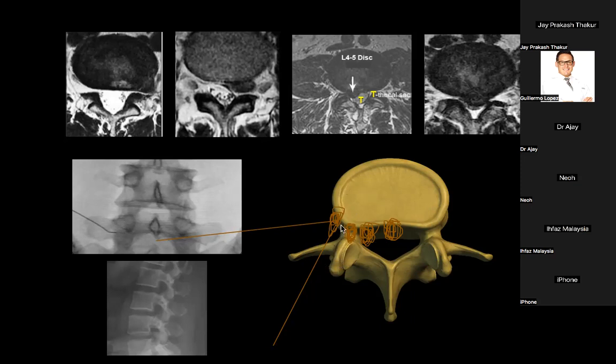That means if you look at this pedicle, can you see the pedicle? Now this is another important terminology which we discuss in the anatomy lecture also. There is basically a lateral pedicular wall, the mid pedicular line, and a medial pedicular line. These are important, right? So in this case, we are keeping it outside the pedicle, the lateral pedicular line. See this? That's the lateral pedicular line, right? We have to keep it outside that because we are not targeting to go inside. For that, we would target a mid pedicular line or a medial pedicular line, depending on the herniation also.